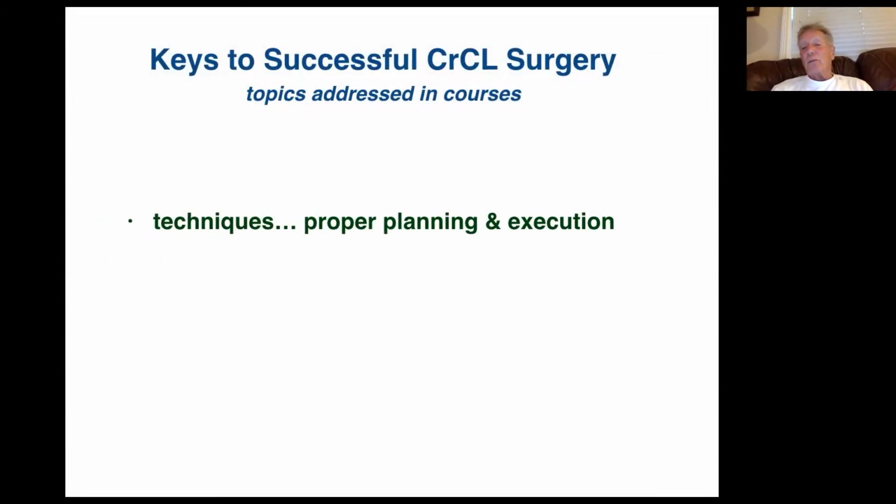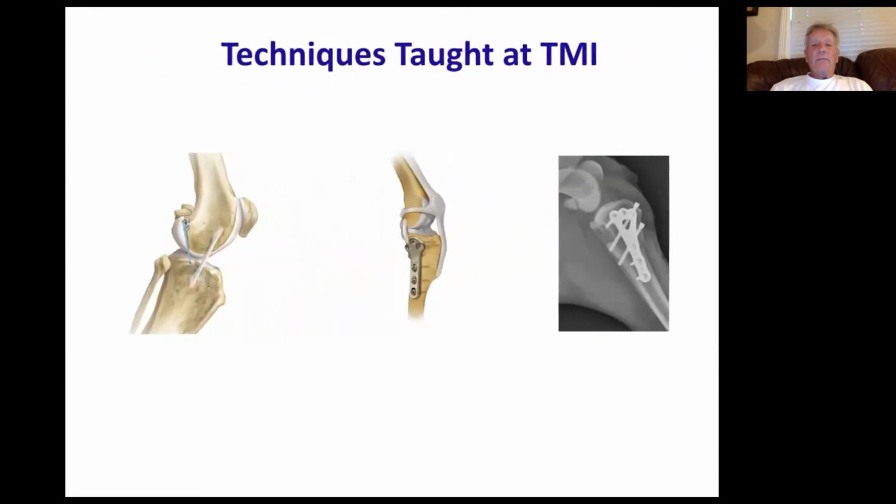So, techniques and proper planning and execution. The techniques that we teach at TMI include extracapsular, and that might be the one if you're just starting out, because of financial considerations and ease of learning the technique. That may be where you want to begin. There are certain cases where that particular technique is probably not the best. If you're already proficient in extracapsulars, you might want to consider learning some of these other techniques.